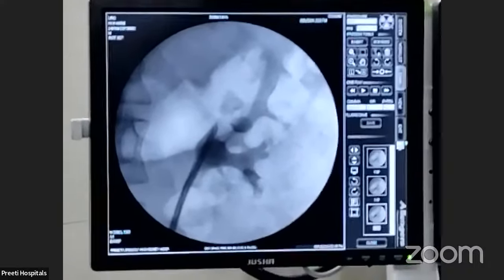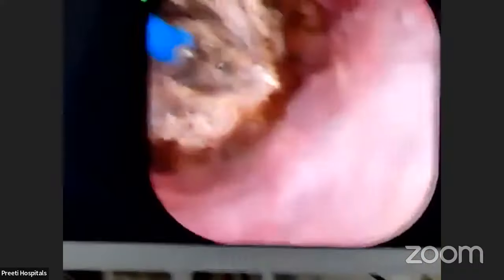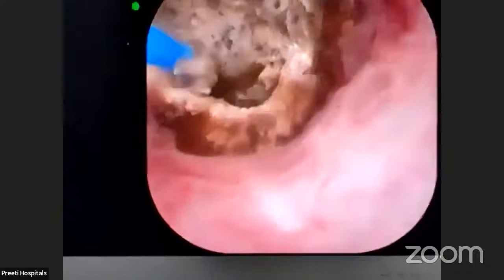So now respiration control, please. Second time I am telling. So now I am making powder. You will not see the powder in the kidney. This is 1.5 centimeters. Keep on doing it. Don't voluntarily make powder. As much as possible, like in normal RIRS, you do it. But at the end, the beauty is that all the fragments can be sucked out.